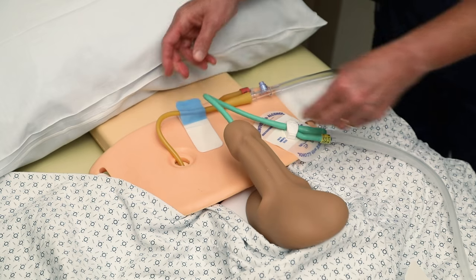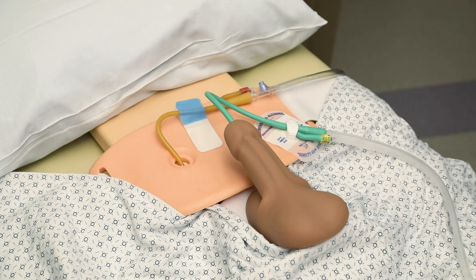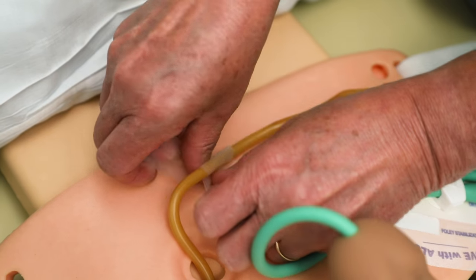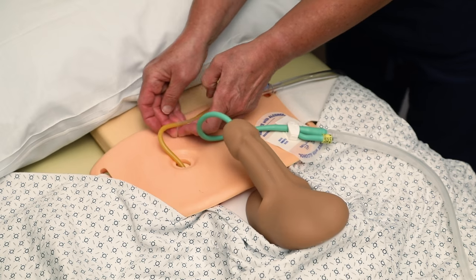In some cases, both the Foley stabilization device and the adhesive anchoring device may be needed. Tape can also be used to secure a catheter or tubing. It is important to make sure tape is secured to tape both before and after the catheter or tubing to prevent slipping.